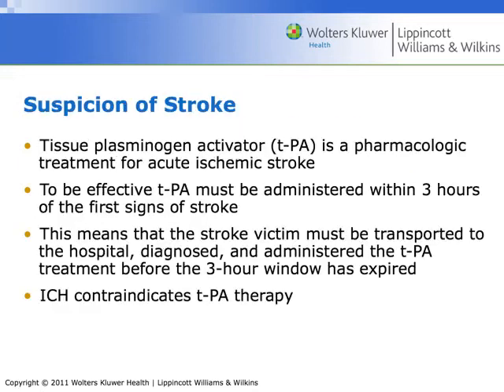So we just want to make sure that we have a nice even coating of contrast media throughout the area that we're scanning. If we suspect a stroke, so rewind back to the brain scan, and we'll be talking about this a little bit more when we talk about pathology. They're going to do some kind of lab test, and they're going to assess for acute ischemic strokes, but basically the CT is the standard of choice to evaluate for that.